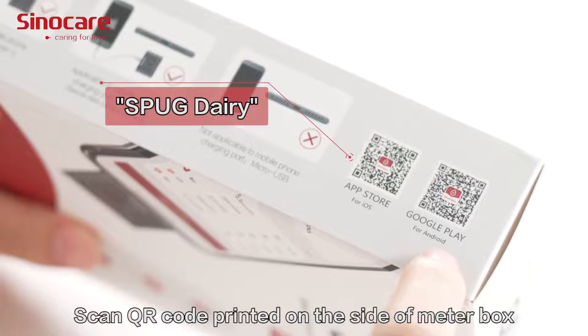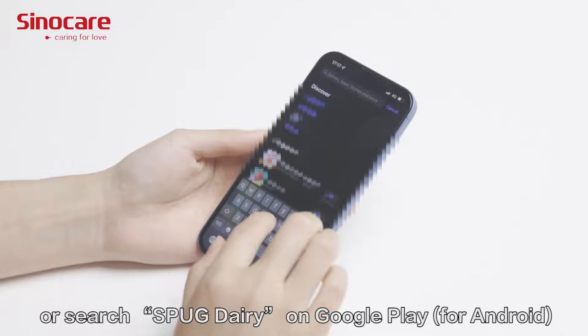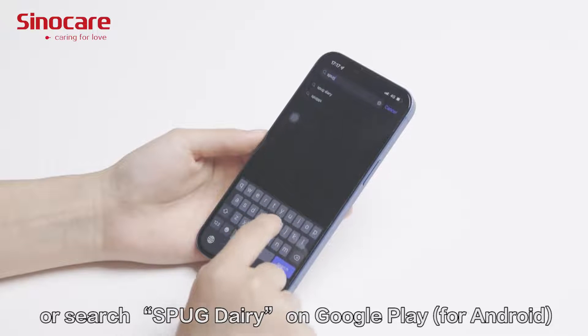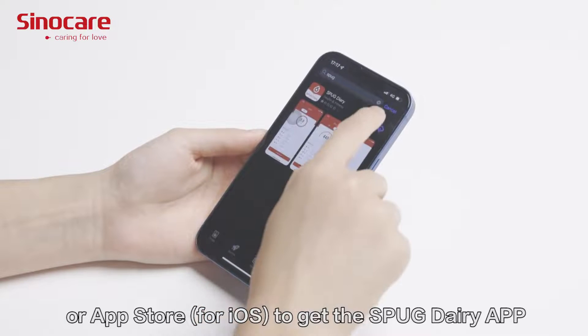Scan the QR code printed on the side of the meter box, or search 'SPUG Diary' on Google Play or the App Store to download the SPUG Diary app.